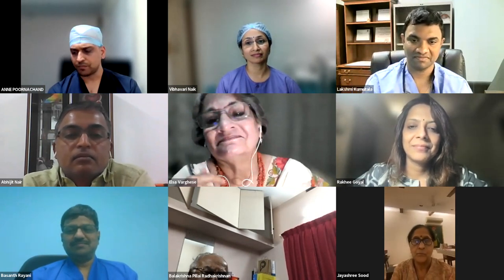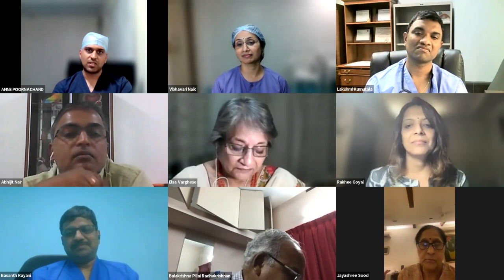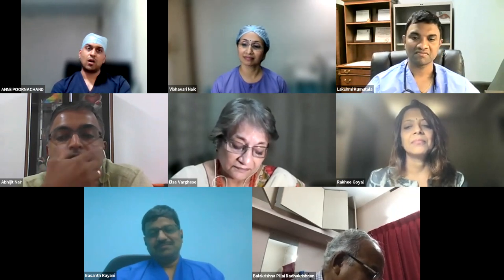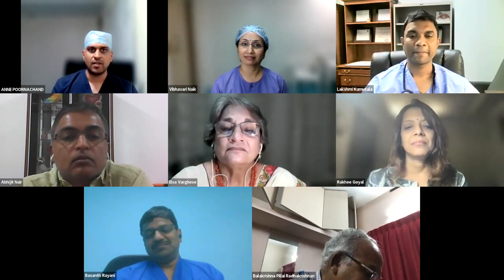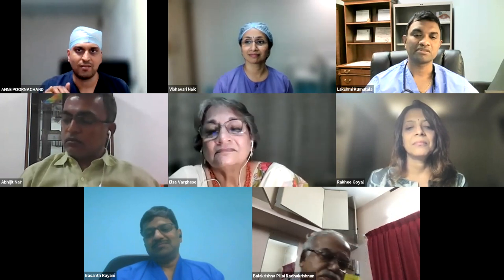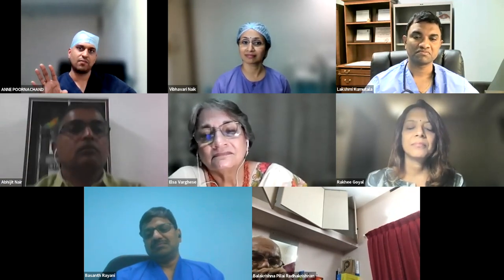Reason being, the most sensitive muscles are the pharyngeal and upper esophageal muscles. So recovery in these muscles happens last. The patient can perform a head lift for 5 seconds and sustained hand grip for 5 seconds. All these are possible at a TOF ratio between 0.4 and 0.7. But in the majority of patients, the pharyngeal and upper esophageal muscles recover at a TOF ratio of 0.9, which is missed on a clinical basis. These patients tend to have upper airway collapse and hypoxemic events.